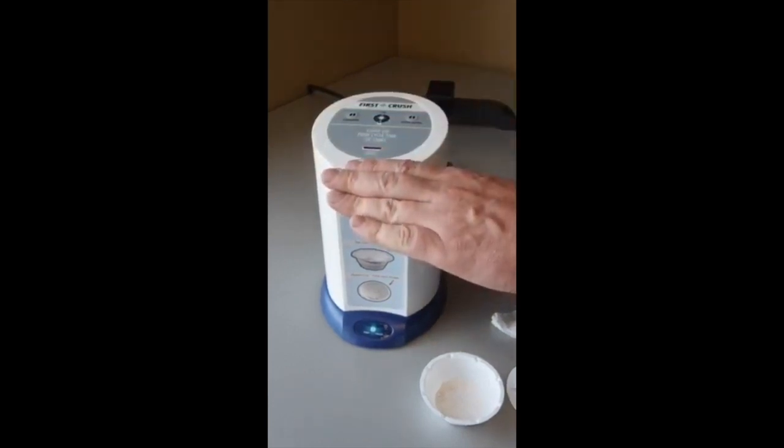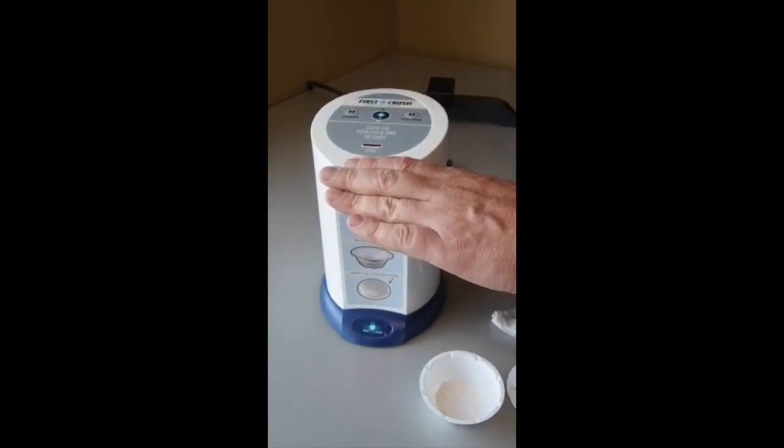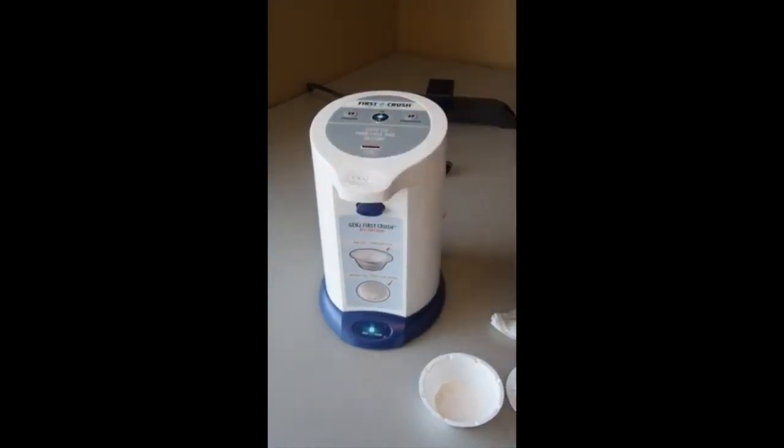If ever the lid gets stuck, simply hold on the lid with a little pressure and push either the standard or extra grind button to cycle the unit one more time. This should alleviate the internal mechanism and unlock the lid.